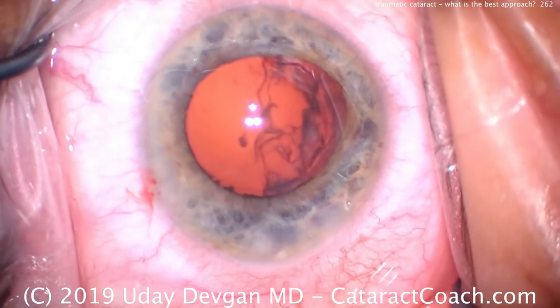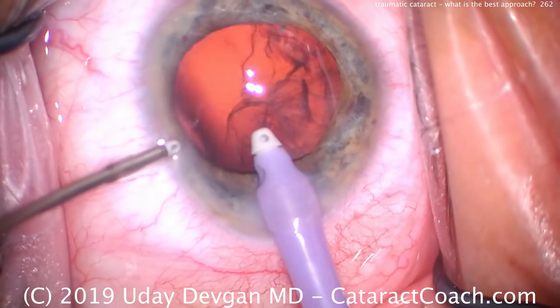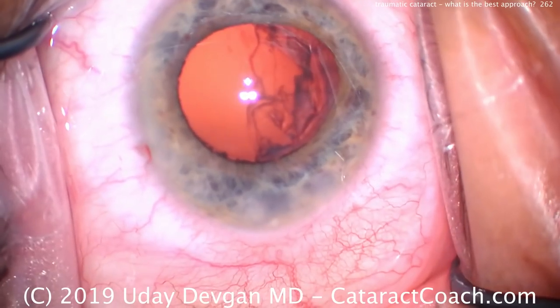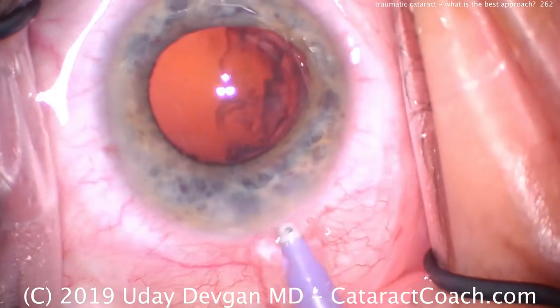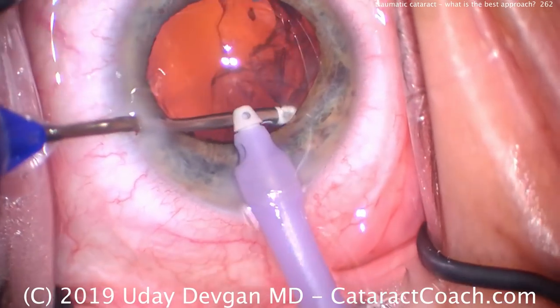All looks pretty good. Now, for the second half of this cortex removal, we're going to split this into a bimanual approach. The right hand is just the infusion. The left hand now is the aspiration. So we'll just adjust that tip to the way we like it. There we go. Put that inside the eye. And be very gentle here.